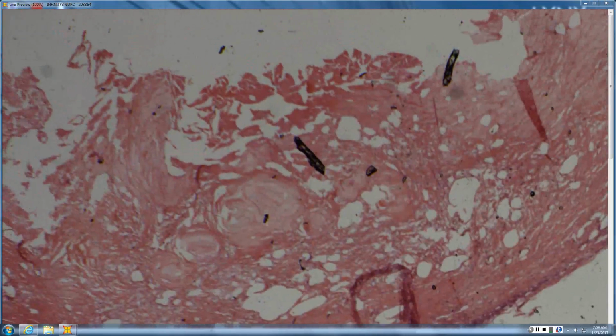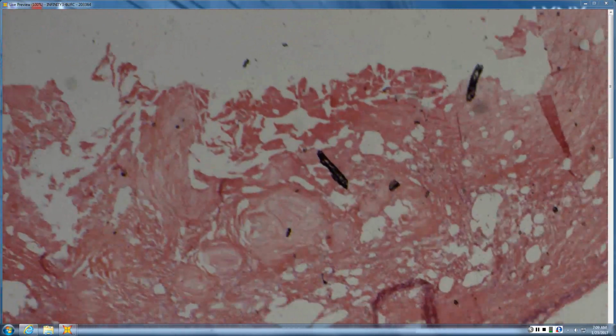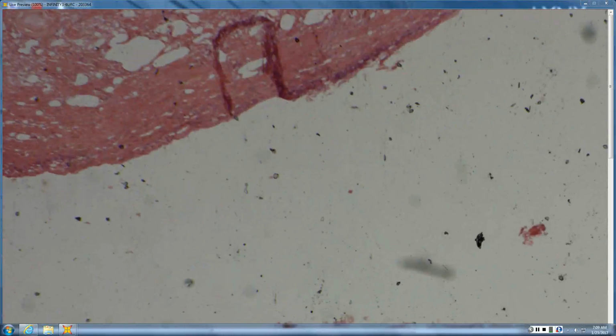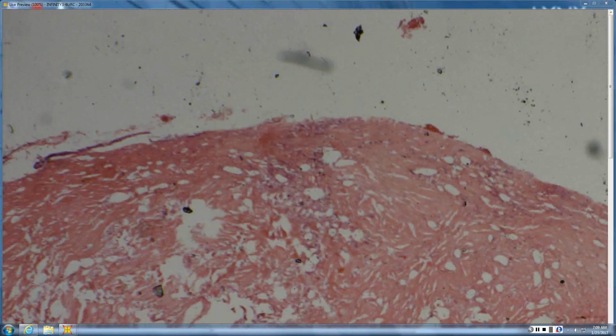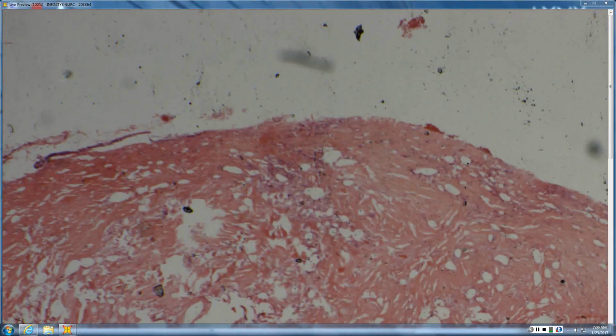This is an example of a sclerosing lipogranuloma, which is in the latter context. So somebody injected foreign material for who knows what reason, and the body is reacting by getting that sort of surrounding sclerotic change around the foreign material. This one is sclerosing lipogranuloma, which I don't know if he covered that in his.